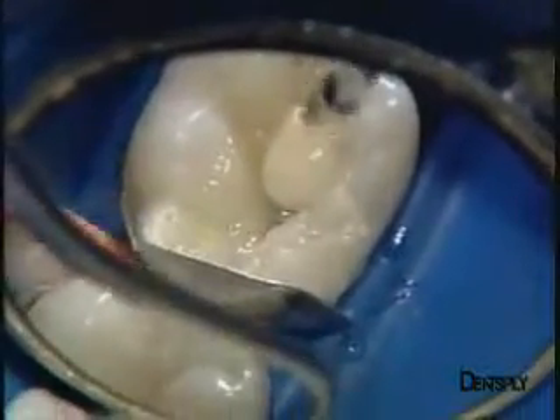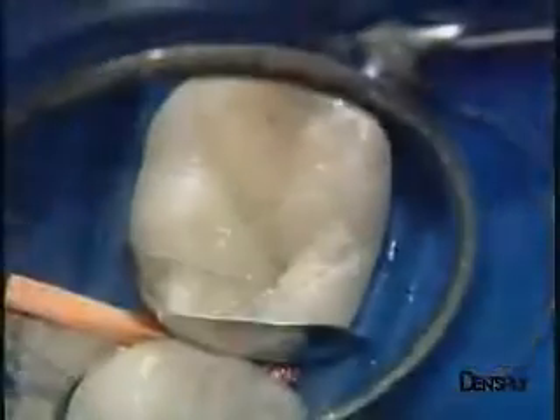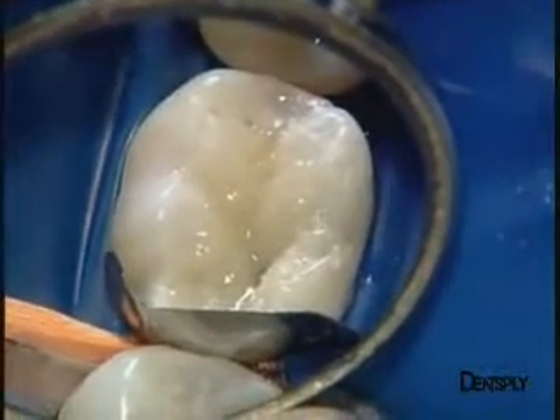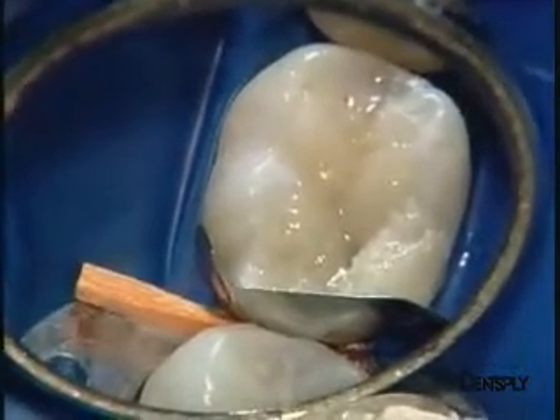The fissures are at the meeting point of the various masses of composite that make up the bulbs. They are not drawn as such, as this gives a much more natural anatomical configuration. This picture already shows the good aesthetic integration of our Ceramix Mono restoration.